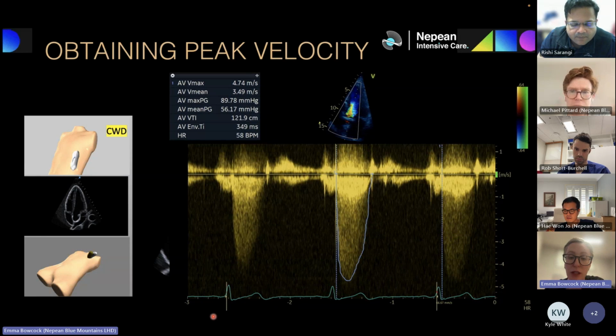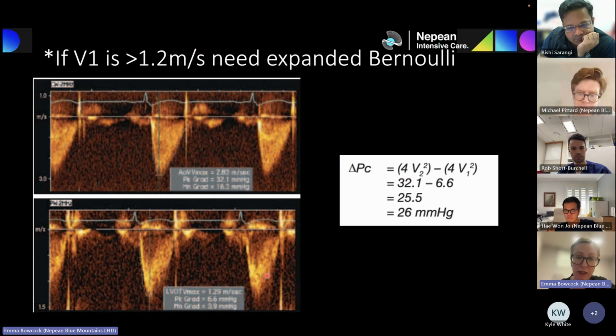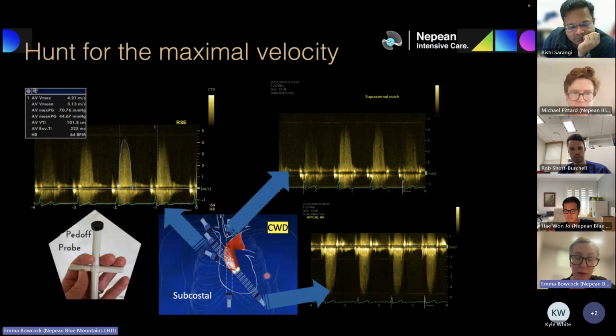Mitral regurg starts off parabolic when it's mild and then becomes triangular when it's more severe because of that V cutoff thing that's happening. So it's important to look at density, making sure you've got your gain settings right, making sure you're not tracing the fuzz down here. And look at getting an idea from the shape as well. There's another reason why you might want to look at the shape, and I'll show you that at the end when we talk about dynamic versus fixed obstruction.